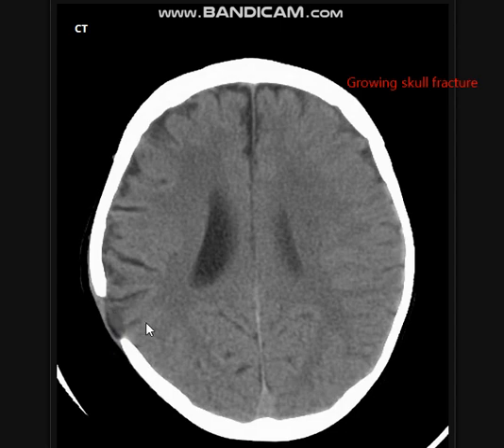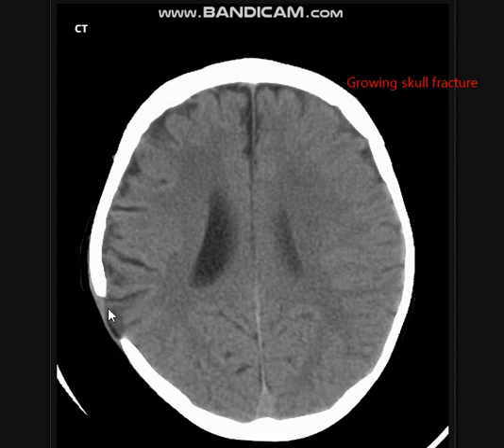The treatment of these patients is sometimes surgical, by placement of a titanium plate to prevent further protrusion of the leptomeninges and brain parenchyma, or further widening of the bone defect. This is the first case of an uncommon skull fracture — what we call a growing skull fracture.